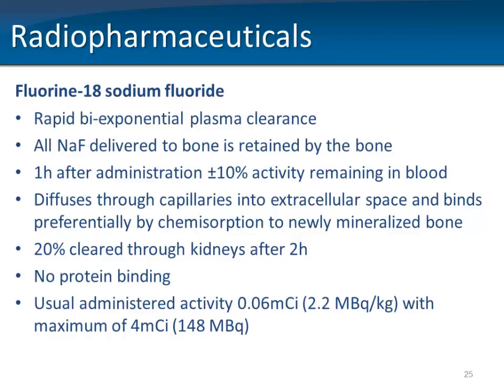So moving on to sodium fluoride PET-CT, of course, a different technique. Pharmacology is somewhat different. You have a bi-exponential clearance, and basically all the sodium fluoride that is delivered to bone is retained by bone. And you see that after 1 hour, approximately 10% remains in the blood. Uptake follows the diffusion into the extracellular space, and binding preferentially occurs due to chemisorption to newly mineralized bone. In contrast to MDP, there's no protein binding, and again, for the dose or activity, I should say, I refer you to the dosage card.